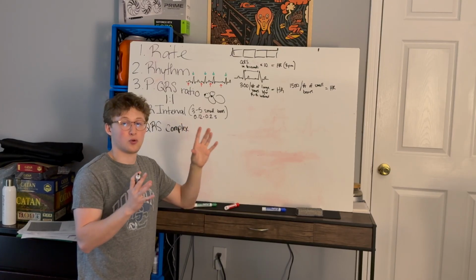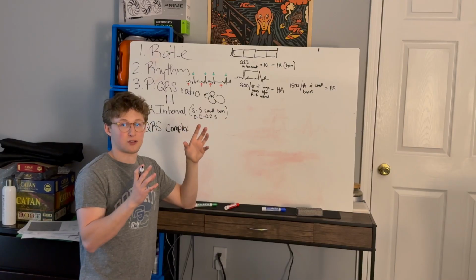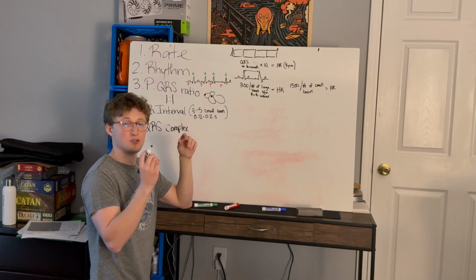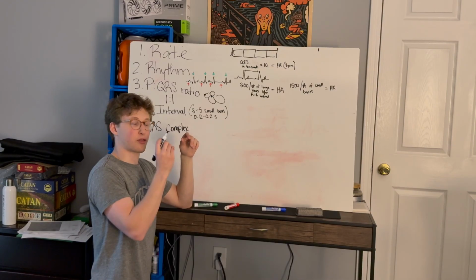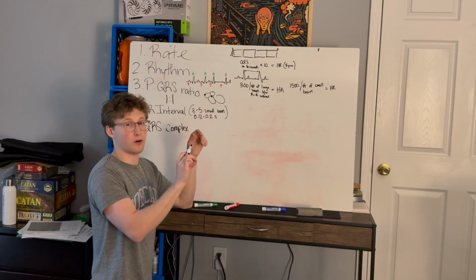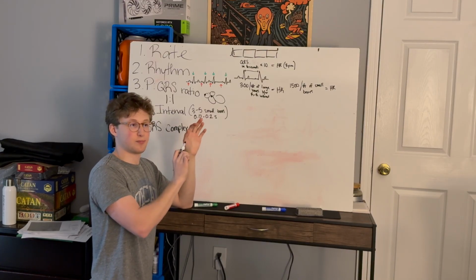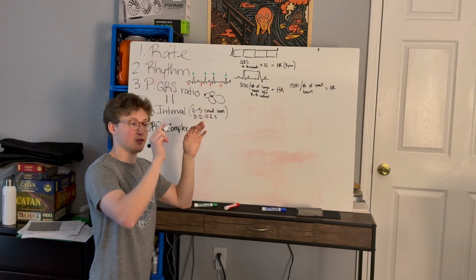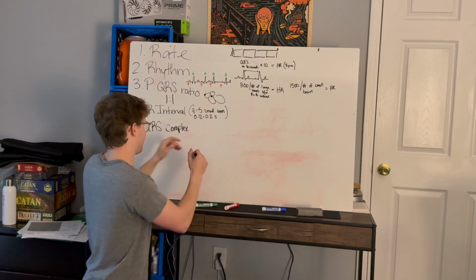It should be very quick. The Purkinje fibers are extremely fast conductive tissue. It should not take longer than 0.12 seconds or 3 boxes. It should be somewhere between 0.04 to 0.12, but if you remember any number, it's 0.12 or less.